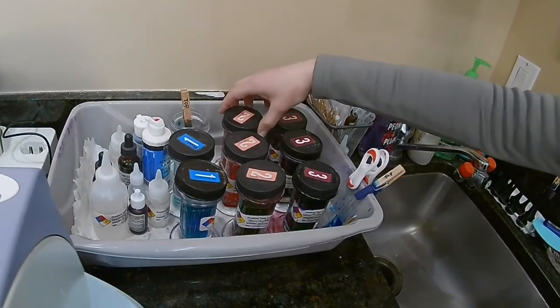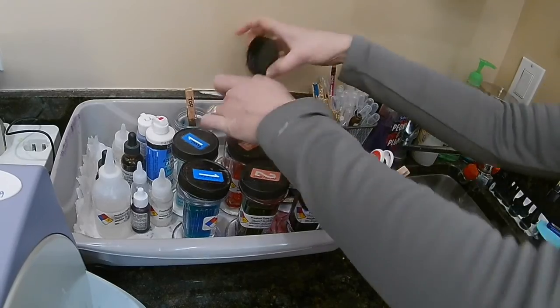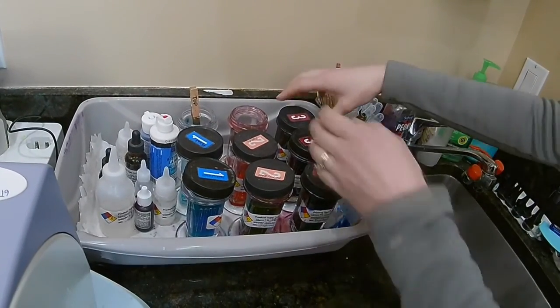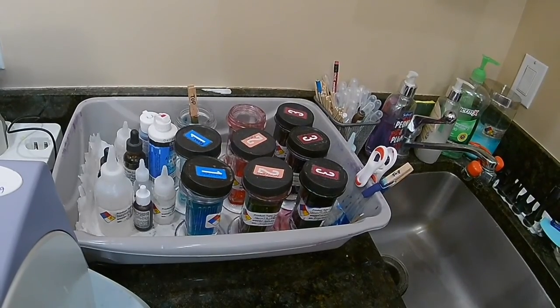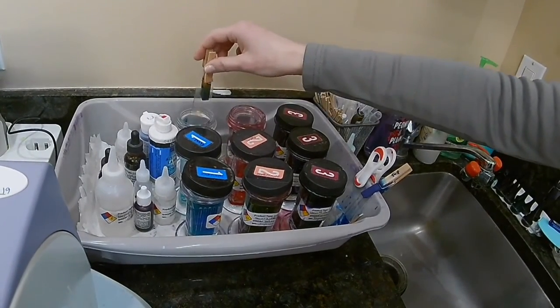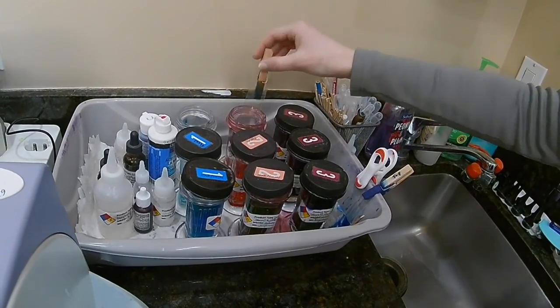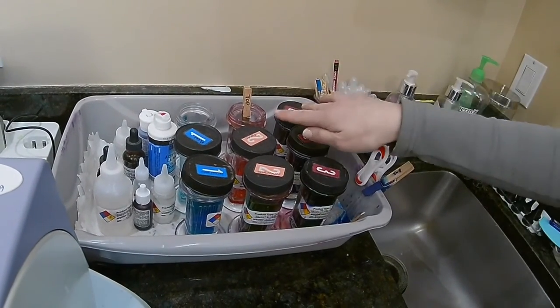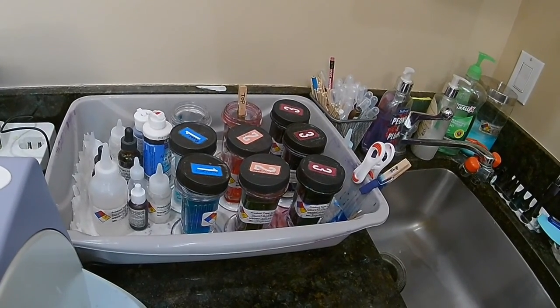We'll be switching over to the second one here. So get that ready. Loosen my cap there. Alright, so now I'm going to tap her off here and switch her on over. Now for these two stains, I'm only going to leave them in for about 15 to 30 seconds.